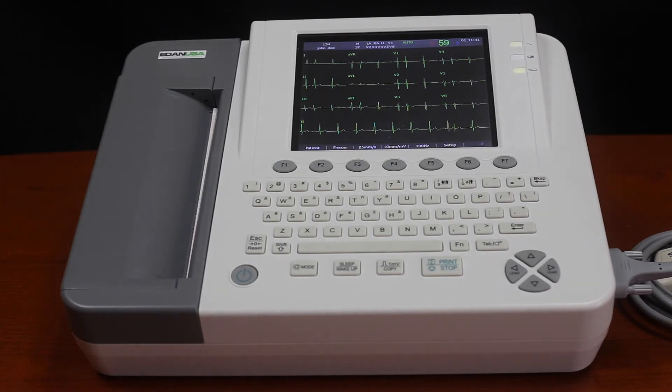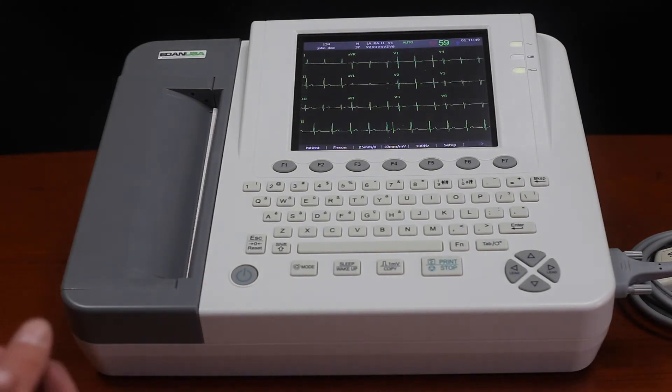It also has Wi-Fi capabilities that come included with the system, so you can transfer patient data right to your EMR.